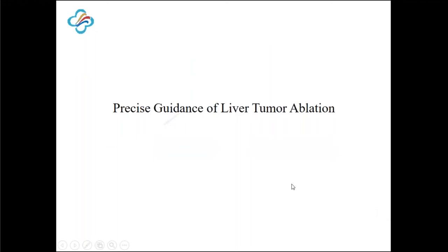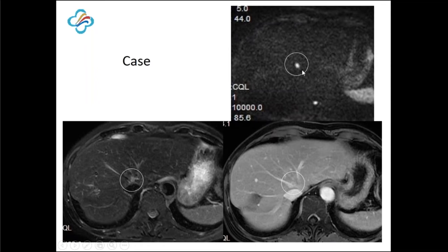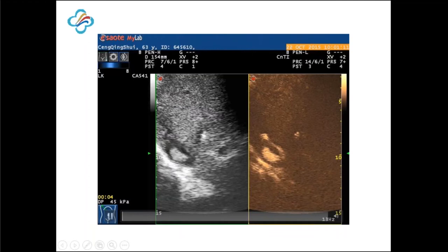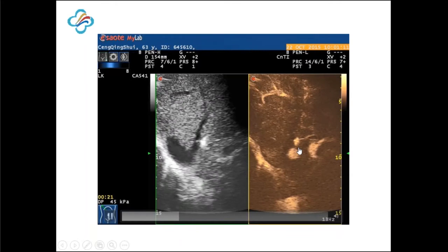The second part is precise guidance. For this case, there is a very small lesion in segment four, and it's very close to the inferior vena cava. While doing the ablation, we use contrast-enhanced ultrasound to do the guidance. We can see the lesion here, and we can also see the needle tip. Then we insert the electrode.